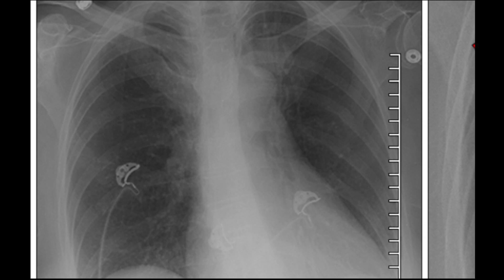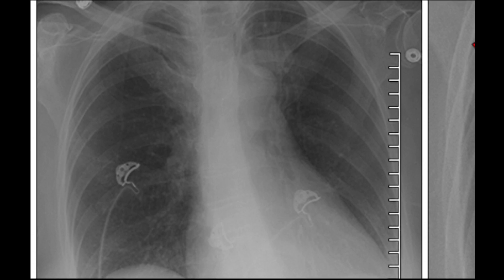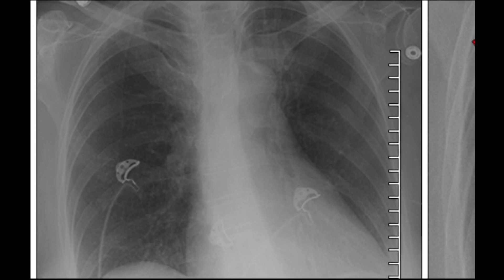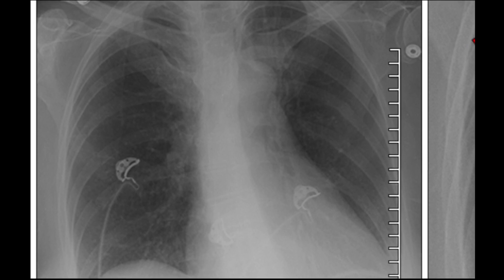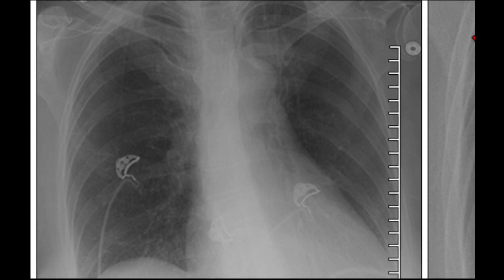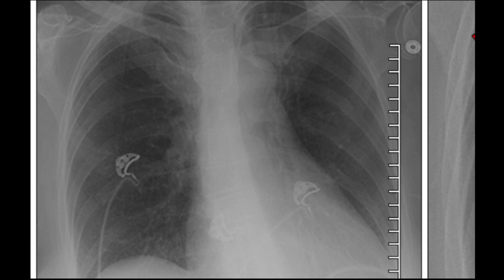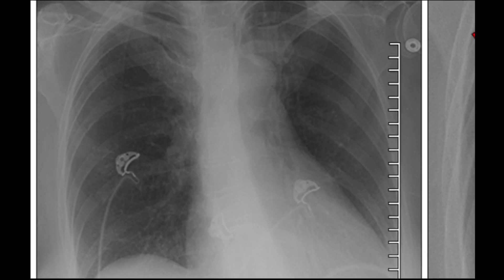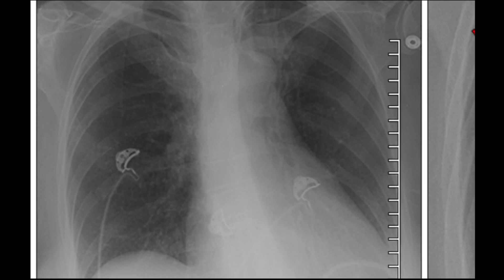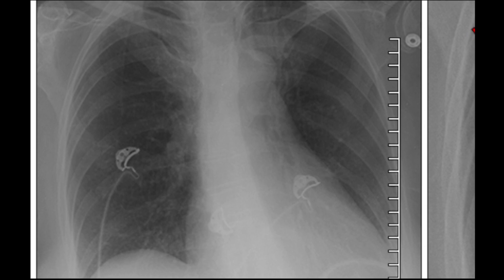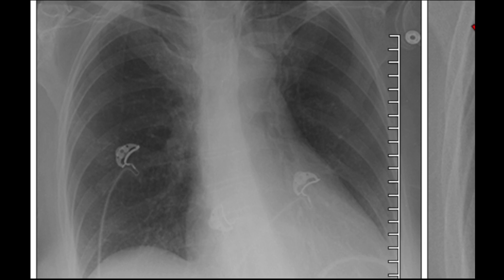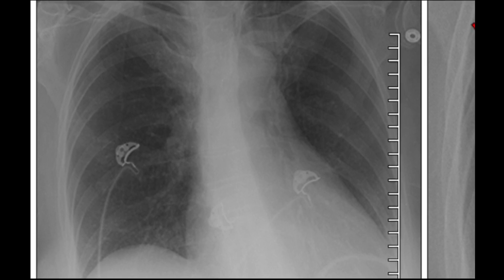Looking at this next chest X-ray — this picture is a little cropped so you can focus on the main problem. The airway looks well; the trachea was midline and straight with no foreign bodies. Looking at the bones, there's no sign of clavicular fractures. I like to follow the ribs starting at the sternum and follow them down until they wrap around to the back. Doing that here, some ribs on the right side appear a little malformed.